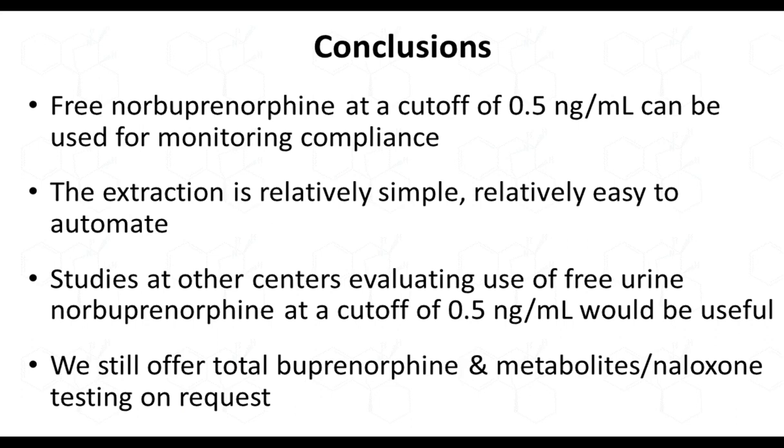So we are getting so many good questions today, but it looks like we only have time for one more. So Dr. Stone, what do you use for calibrators and QC material? So we make our own calibrators in drug-free urine, and we have purchased commercial QC.